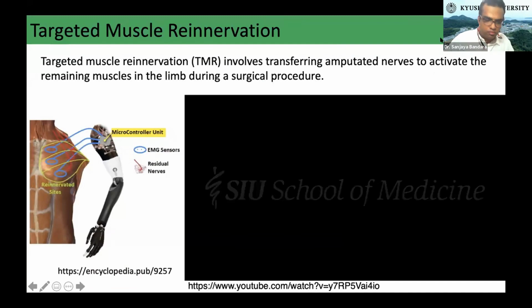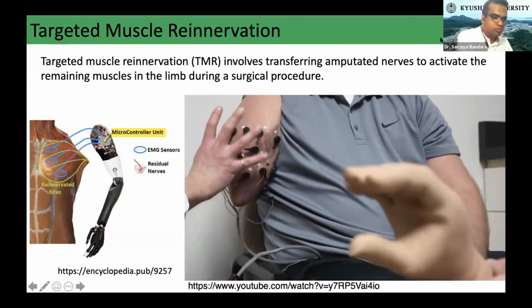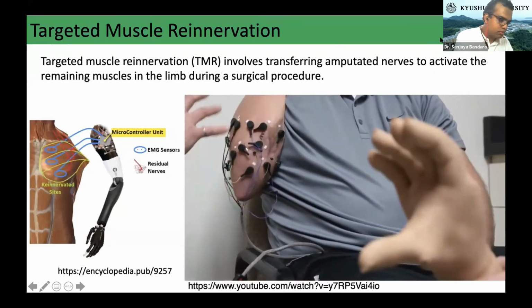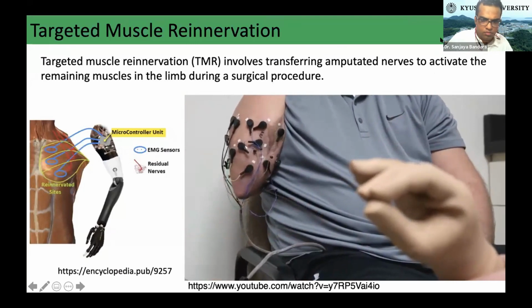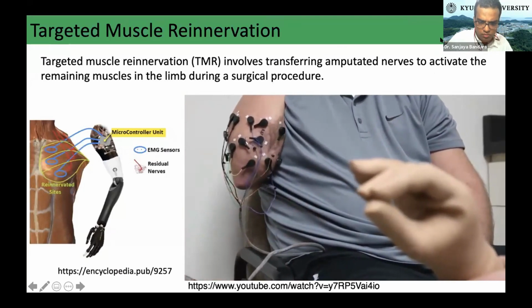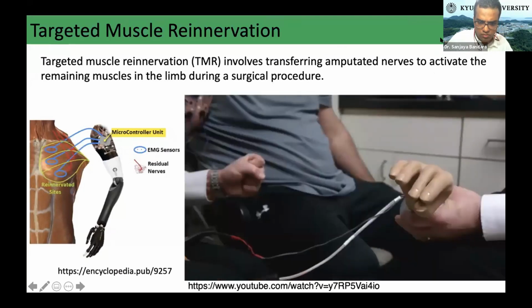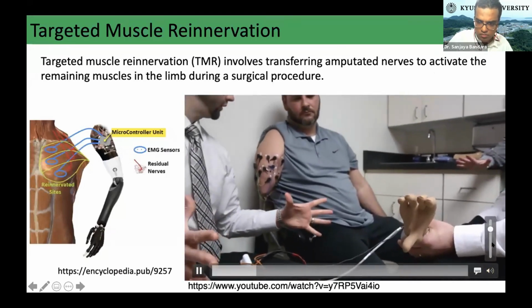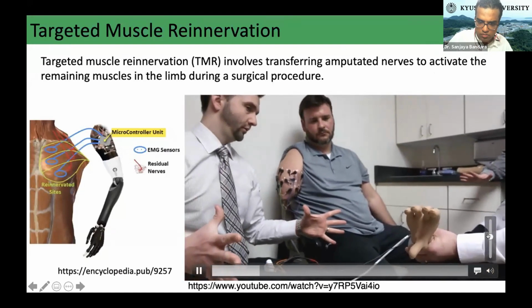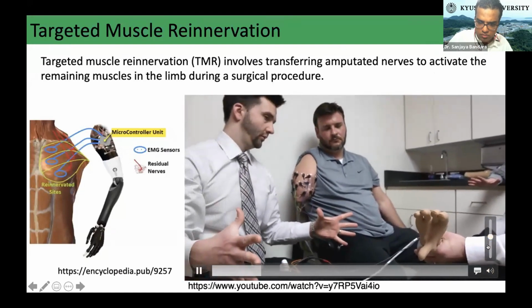The muscle, when you're making those muscle contractions, they emit electrical activity. Kind of like a radio emits music. Same thing. You can turn the radio up and it can be louder. You turn it down, it's quieter. This technology is like listening to a radio. Sorry, the technology that is, I don't want to call it old, but the conventional stuff.